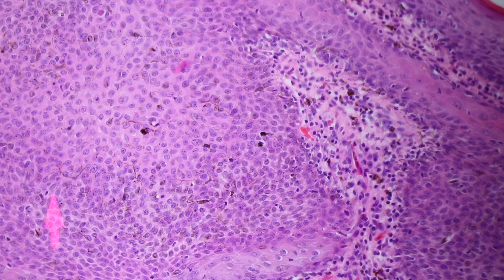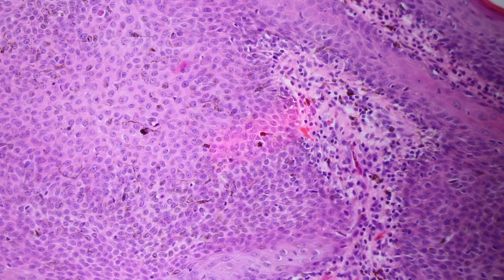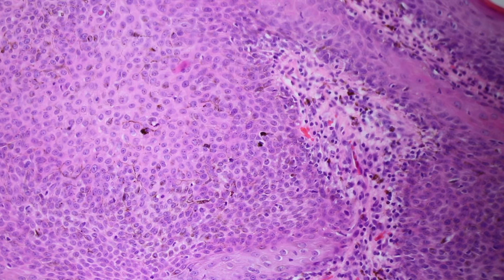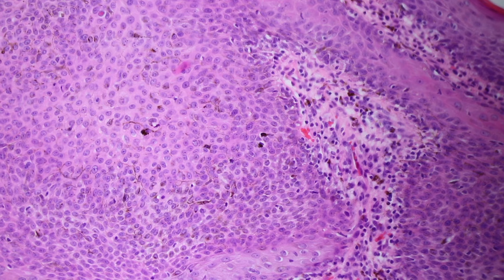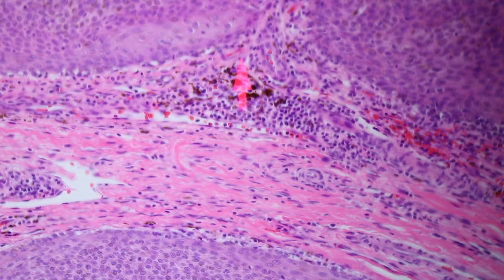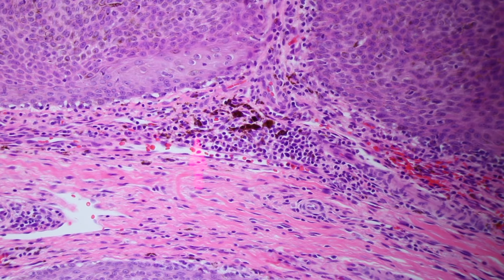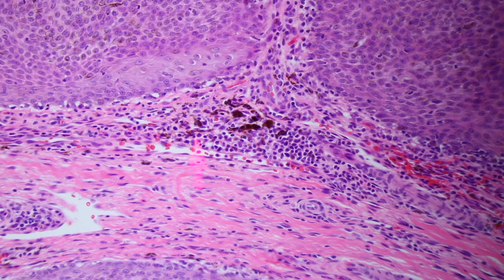Those are actually pigmented melanocytes — you can tell because of their little branching processes. Melanocytes usually aren't very darkly pigmented, but sometimes they are, and sometimes dendritic melanocytes get caught up in a seborrheic keratosis and further contribute to the dark color. When seborrheic keratoses get inflamed, they'll often drop melanin pigment out of the epidermis and into the dermis. Macrophages come and eat that up — those are called melanophages. If you see real dark cells in the dermis, they're usually melanophages, not melanocytes.